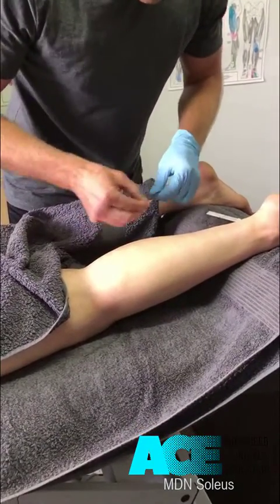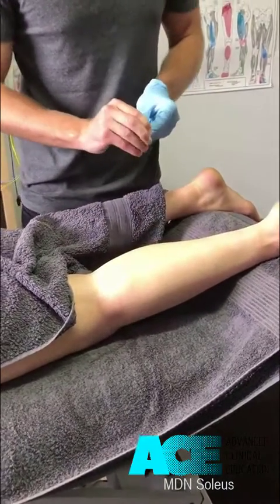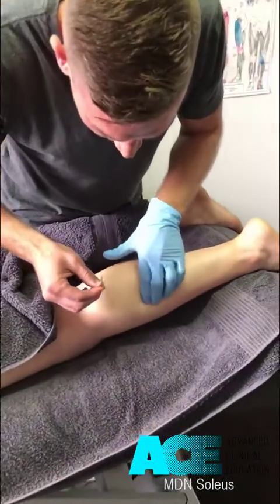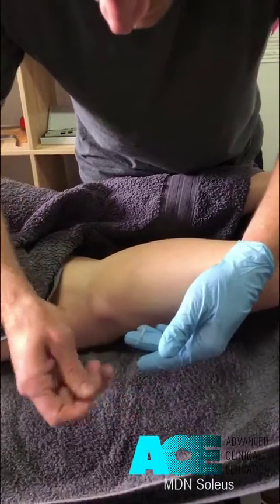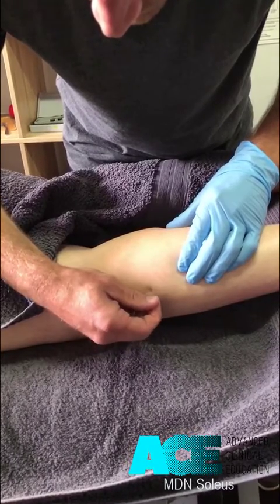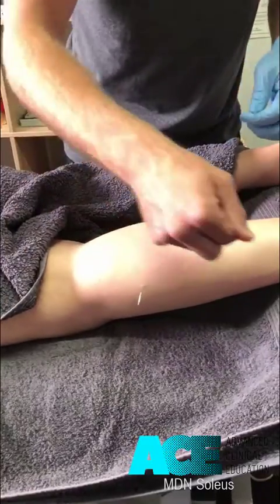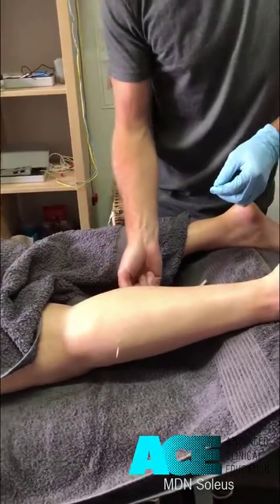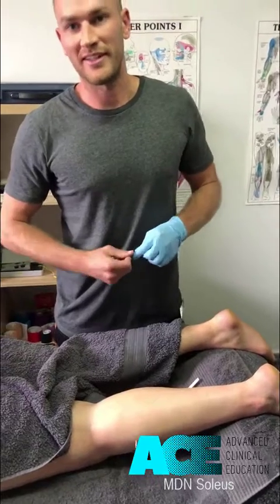Using our alcohol swab to clean the area, making sure that we are on that muscle, the needle is going to get right into soleus. We can target multiple different spots down the lateral aspect of that muscle, and as mentioned, we can also target it medially as well. So that's a dry needling technique for the soleus.